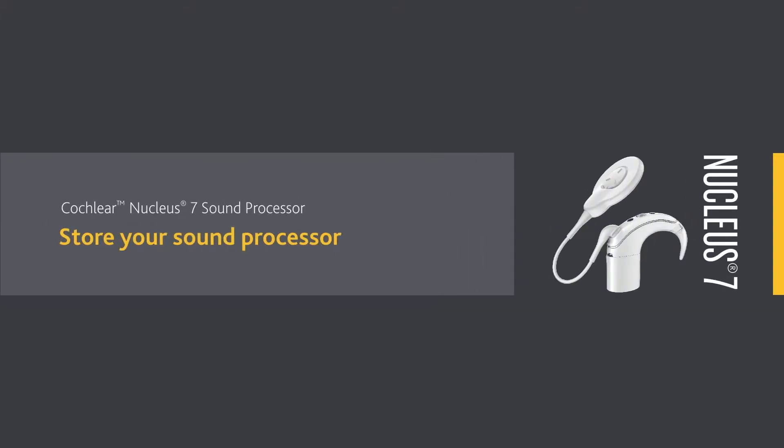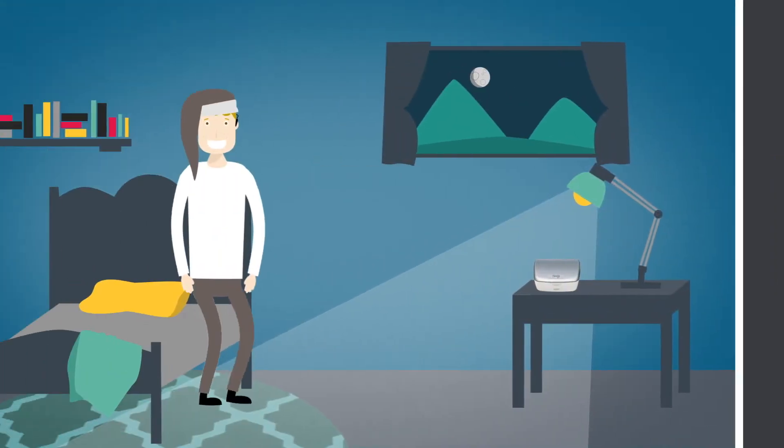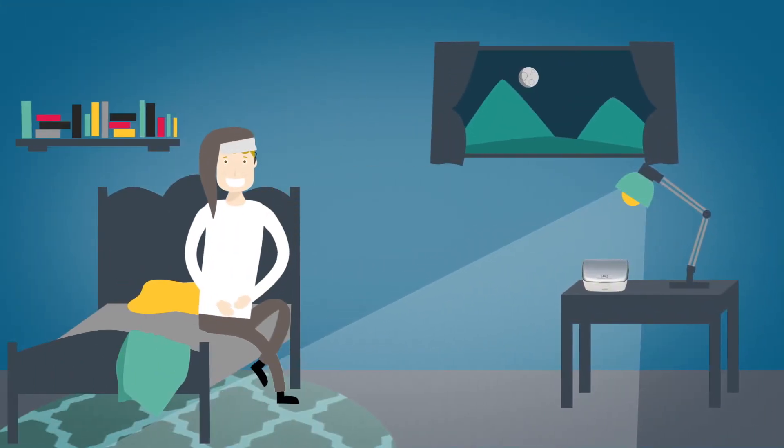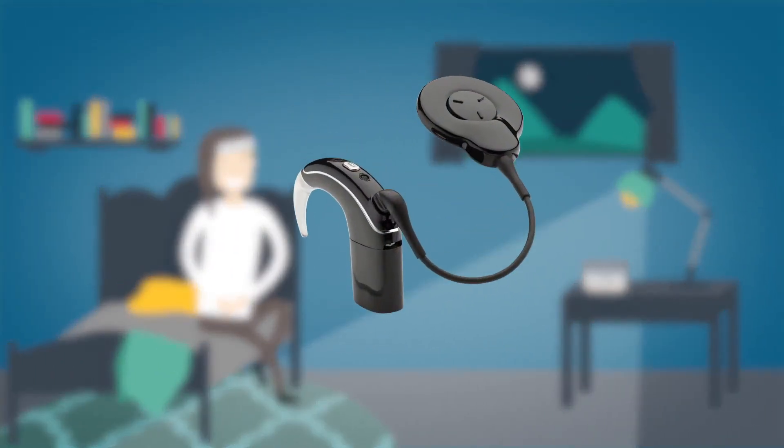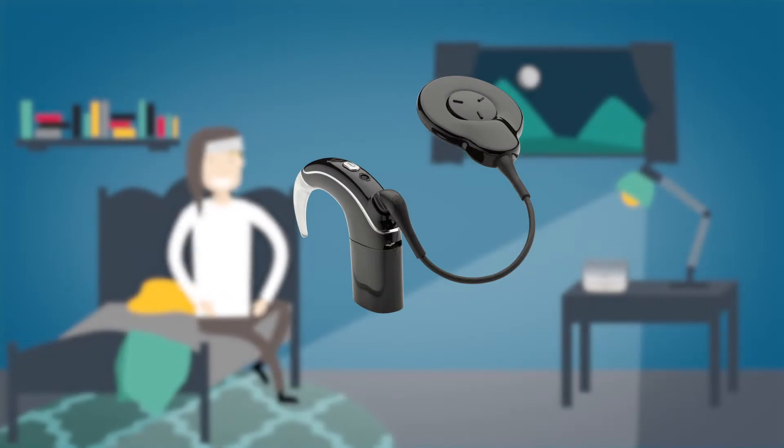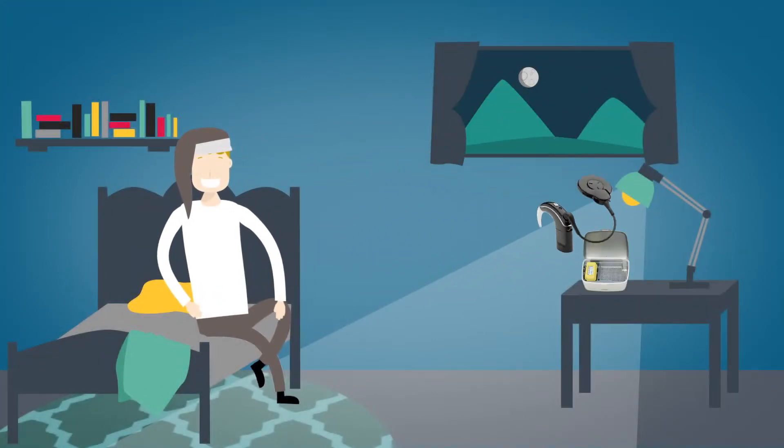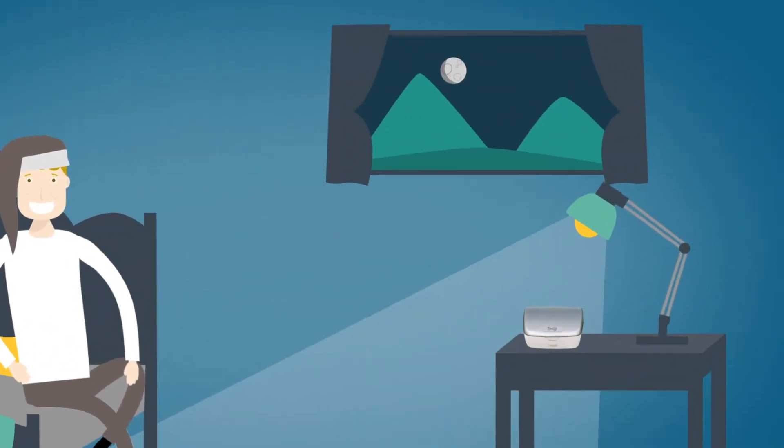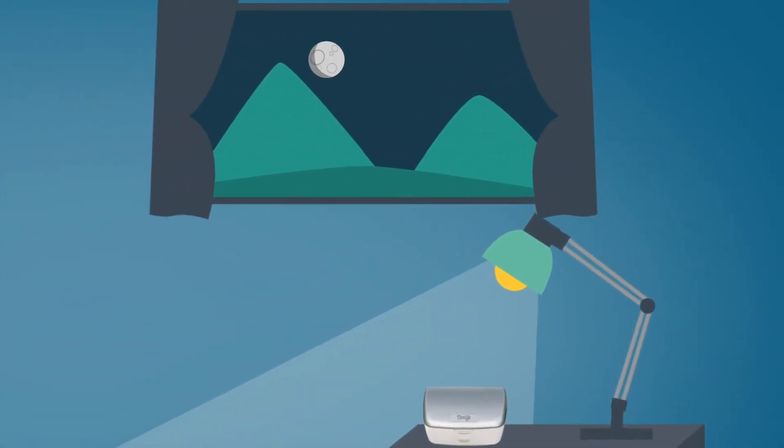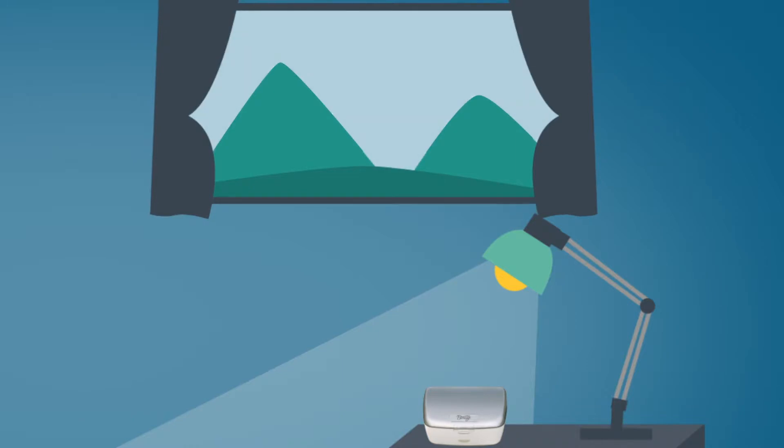To keep your Cochlear Nucleus 7 sound processor free from moisture, make sure that you store it in your DryAid kit every night. For optimal drying effect, store your processor fully assembled for eight hours.